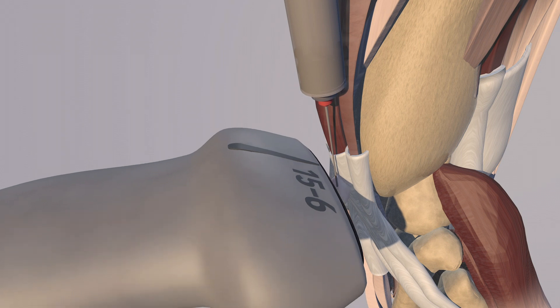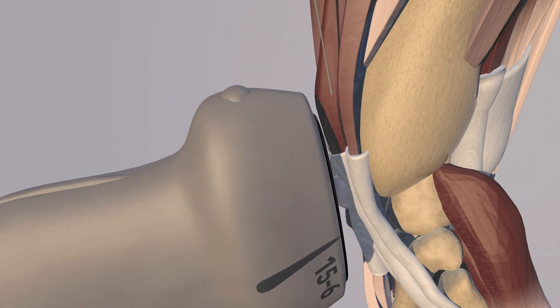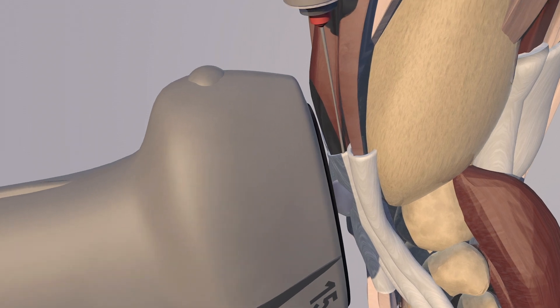So we went ahead and did a long-axis approach to the needle — sagittal to the body — and then we just put the needle right into the tendon sheath, which you can see here zooming in.